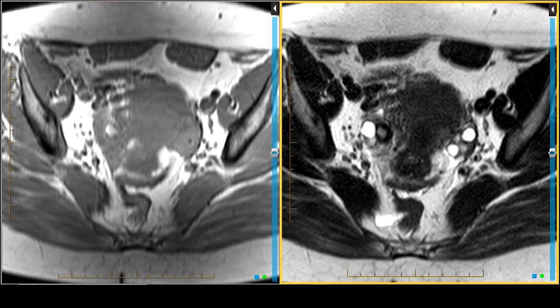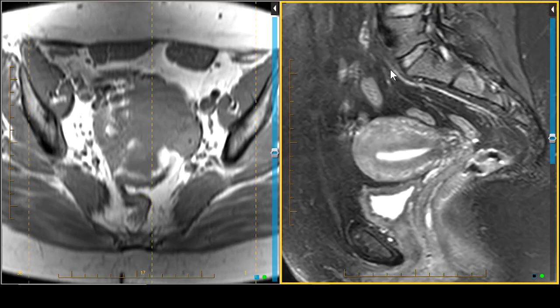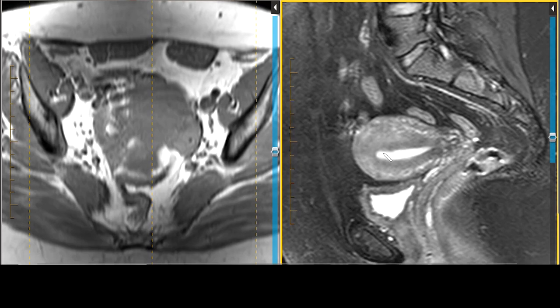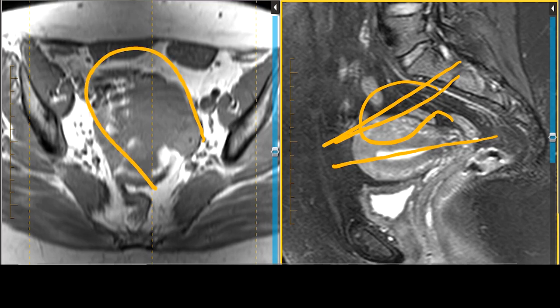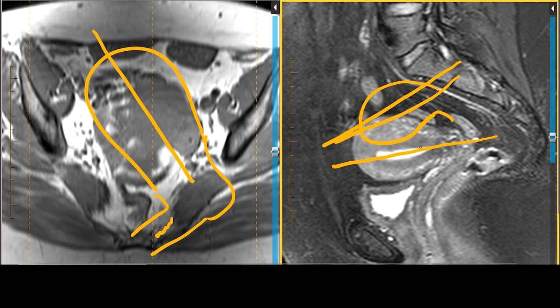Now let me put up the sagittal T2 image and show you how you might get an axial or coronal oblique if the patient has an anomaly. This patient has an anteverted, anteflexed uterus, so the axial that's going to go right down the barrel of the endometrium will be right here. If the uterus was flexed down a little bit more, you would go this way. You always want to be along the longest axis of the uterus, parallel to the endometrial stripe. So if the uterus was standing up, your para-axial or para-coronal would go this way, your cervix would be back here, and your vaginal vault would be down here. This is showing you how you would acquire in the para-axial or para-coronal projection — the proper plane of imaging if you are searching for an anomaly such as a uterus didelphys, septate uterus, or bicornuate uterus.